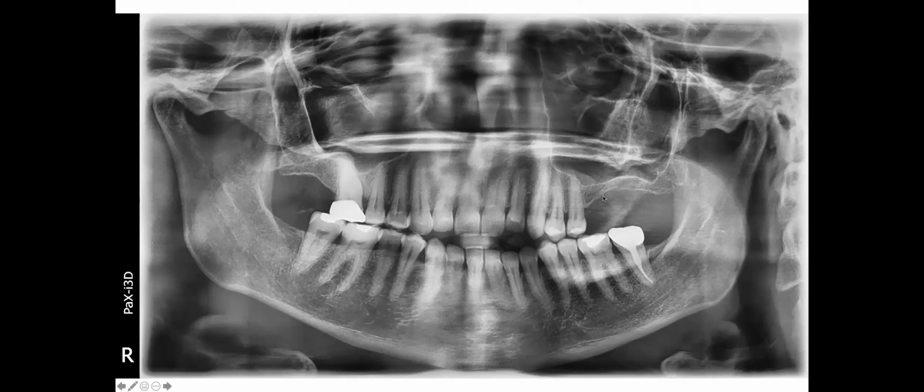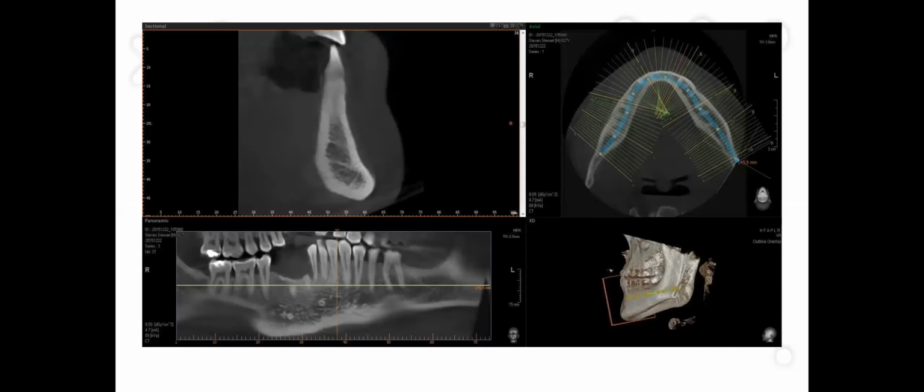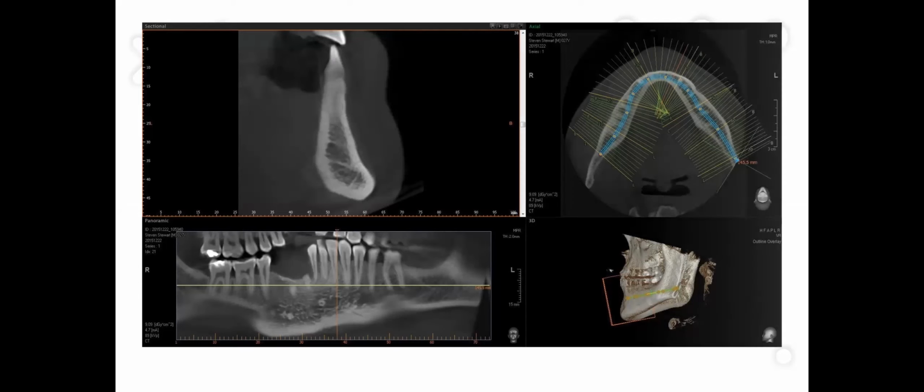And even the width of bone, if it's available for a 5 millimeter diameter implant, you can have an ideal implant placed here, but the crown to implant ratio, your crown height is going to be this length, and that doesn't lead to a favorable occlusal force on that implant. And then with 3D imaging, you have a lot more resources available here. You can look at the width, you can look at where the vital structures are, do a lot more pre-treatment planning with 3D imaging.